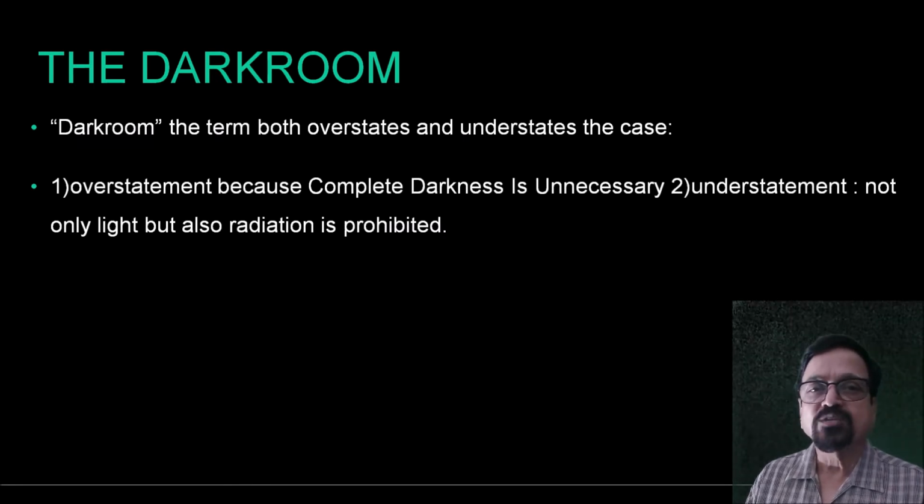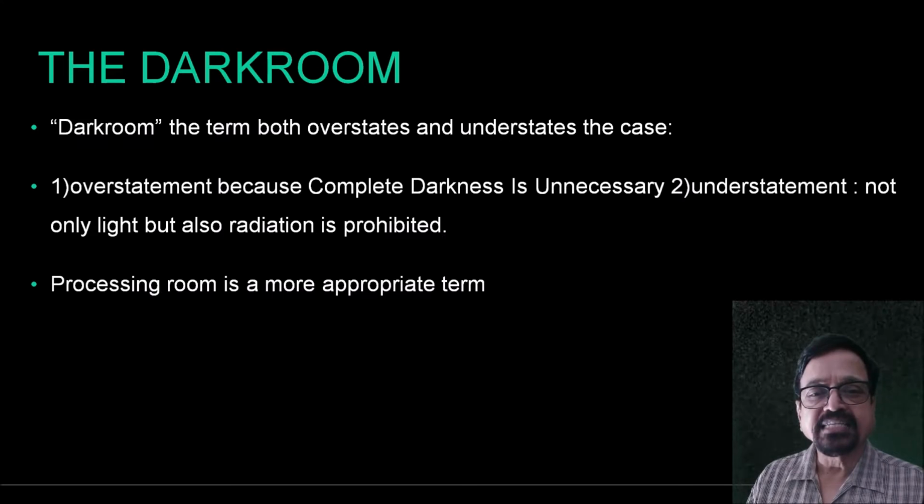So a dark room has got roles. One thing is to prevent the light to which the films are sensitive. Number two, it should have adequate light so that a technician or technologist can work in it. And third thing, it should adequately protect the person working as well as the films from the radiation, since the darkroom is usually situated in the center of the department.